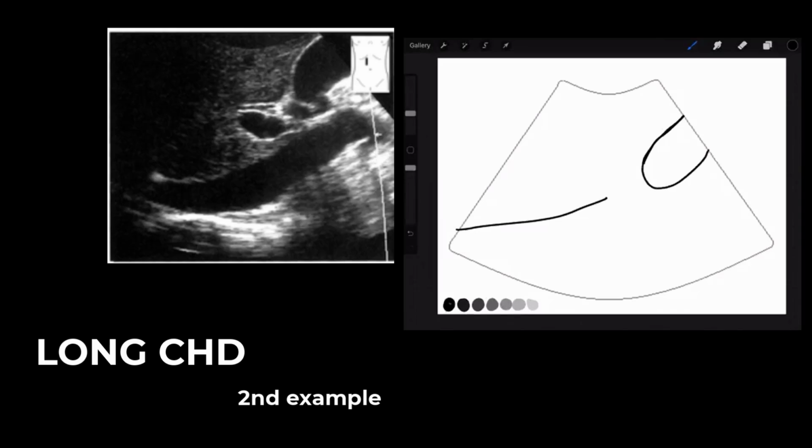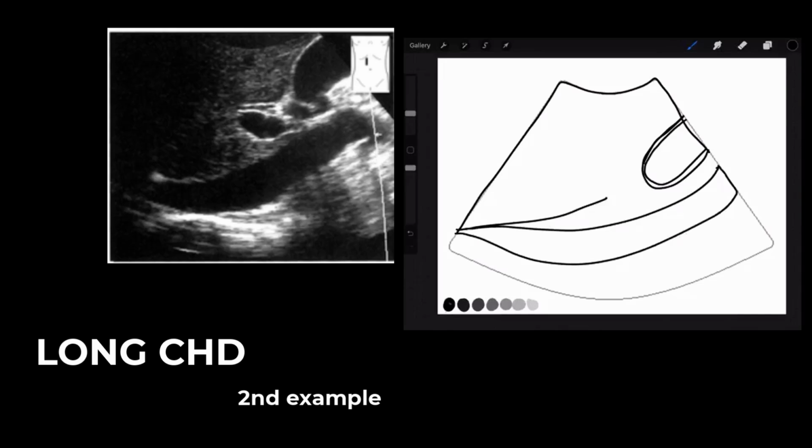So again, here I am drawing the liver. The gallbladder is often seen in this picture since we are in that area. We can see a gap in the liver tissue creating porta hepatis. We can also see the IVC though in this image as well. It is not uncommon for new scanners to confuse the IVC with the gallbladder. You can see their proximity in this picture.